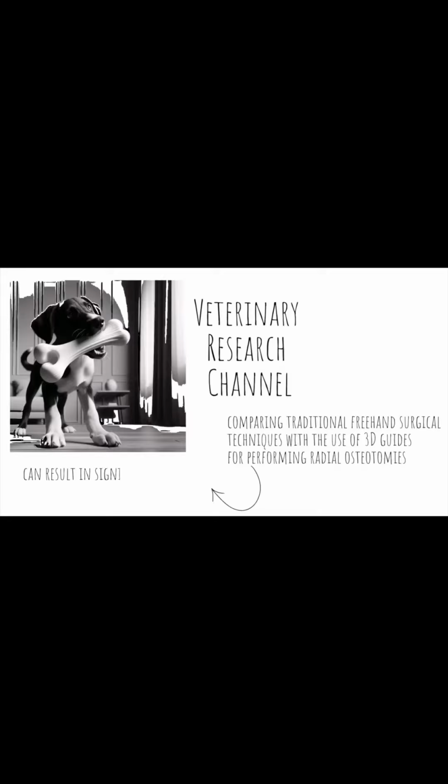Limb deformities are complex conditions in dogs and can cause significant pain and difficulty if not treated. The radius and ulna bones are the most commonly affected, often due to uneven growth between these paired bones. This can result in significant angulation, rotation, and even joint problems. Correcting these deformities requires meticulous planning and precise execution in the operating room.